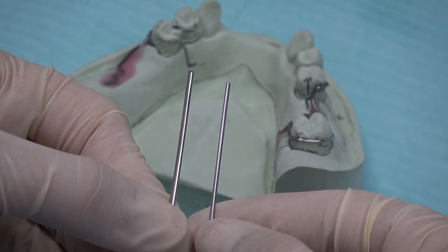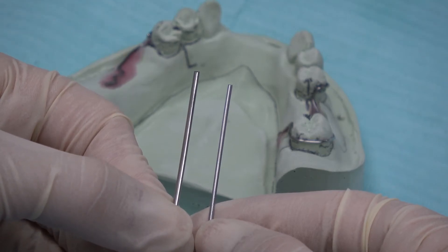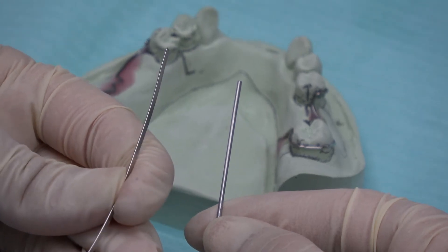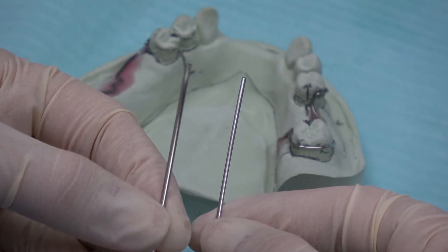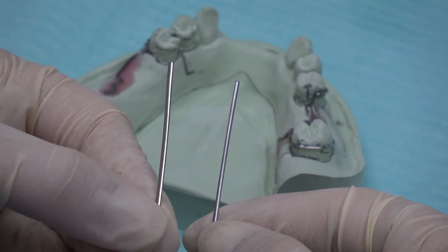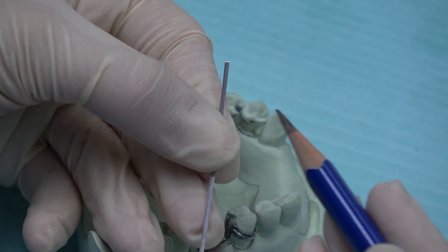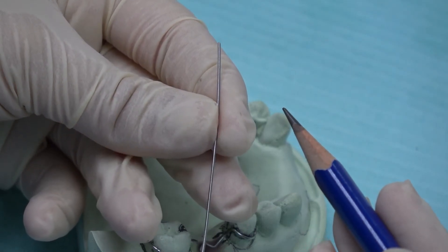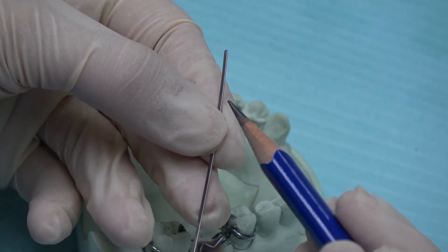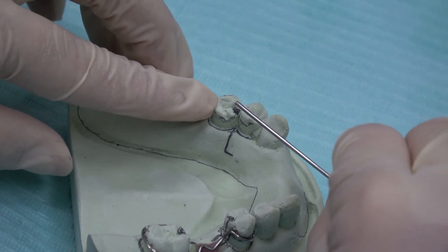I am going to show you how to make rests for acrylic partial dentures. These are called rest wires and they are half-sphere wire. We have two sizes — the bigger ones are for molars and the smaller ones are for premolars. I am going to show you how to bend rest for premolar. The flat surface should face the rest area of the teeth and the rounded surface should face upward.